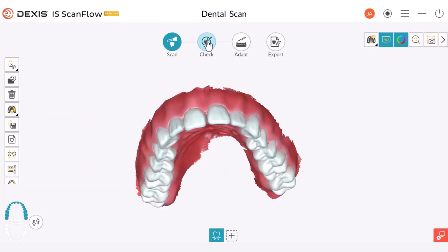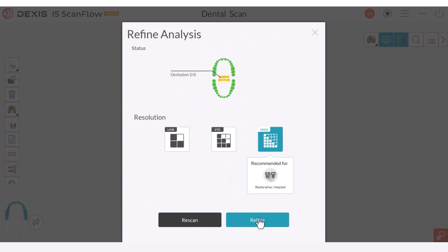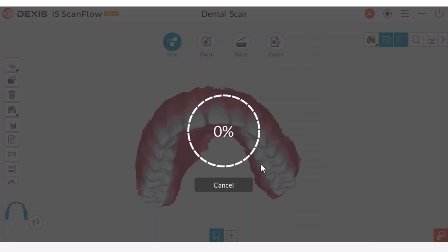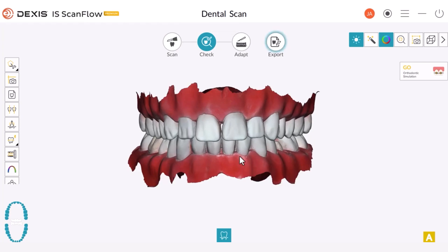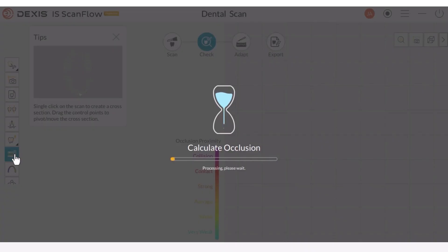Next, I will proceed to the check mode. Once the refinement is completed, we can see that the Occlusion Check option is always available. No matter if you are in the scan or check step, the Occlusion Check tool functions the same way.